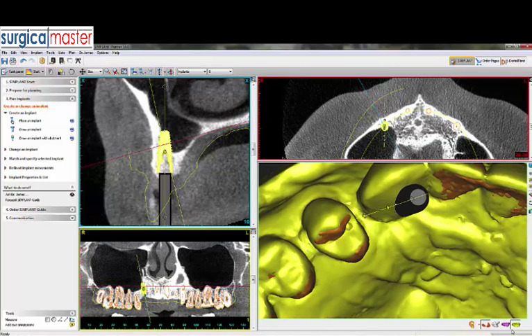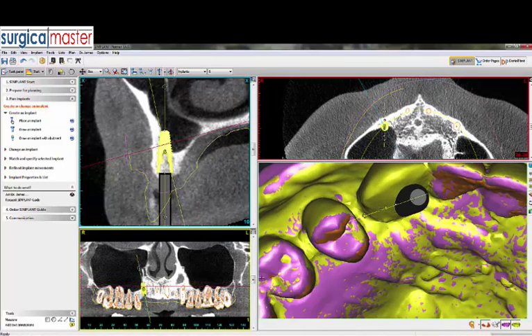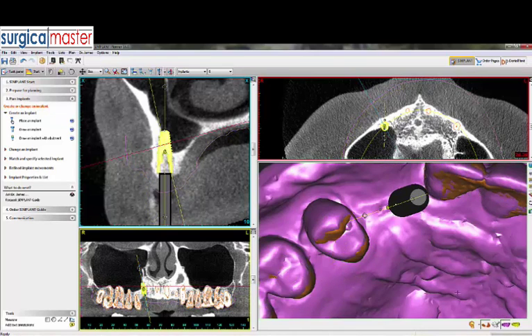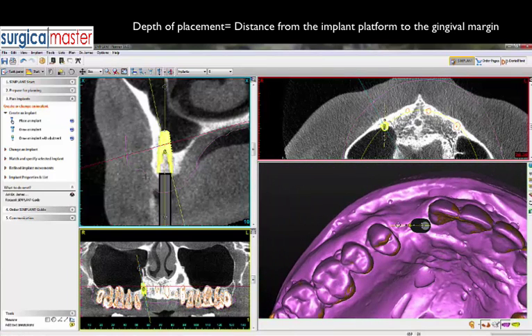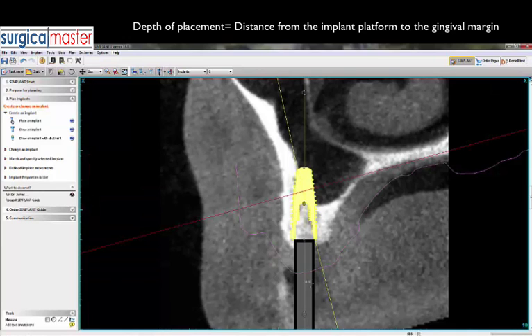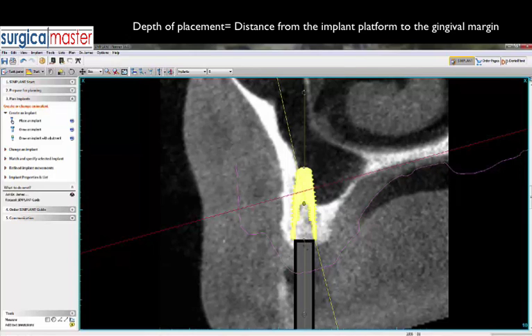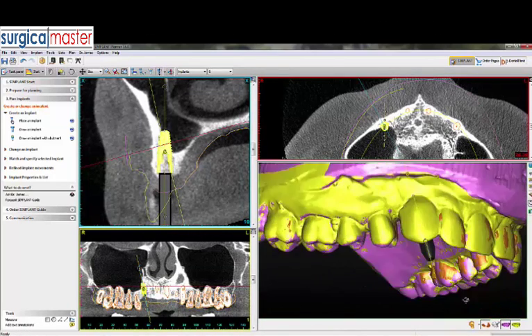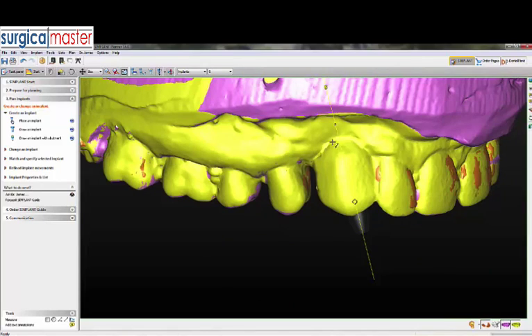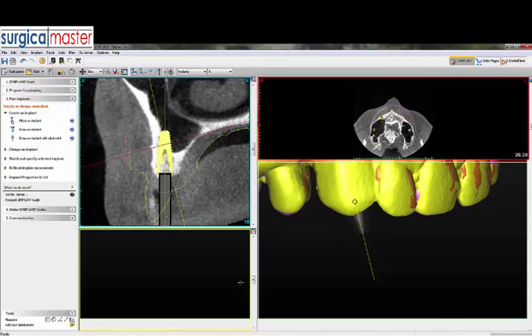I can also measure the depth of placement. I'll turn on the soft tissue here in pink, which will show up on the cross-section as well, so we can make some measurements from the soft tissue to the platform of the implant. For the measurement location, it's very important to turn on the wax-up again because it will show you the CEJ — the CEJ is right here. We need to measure about three millimeters, and we'll see if that's possible in this case.